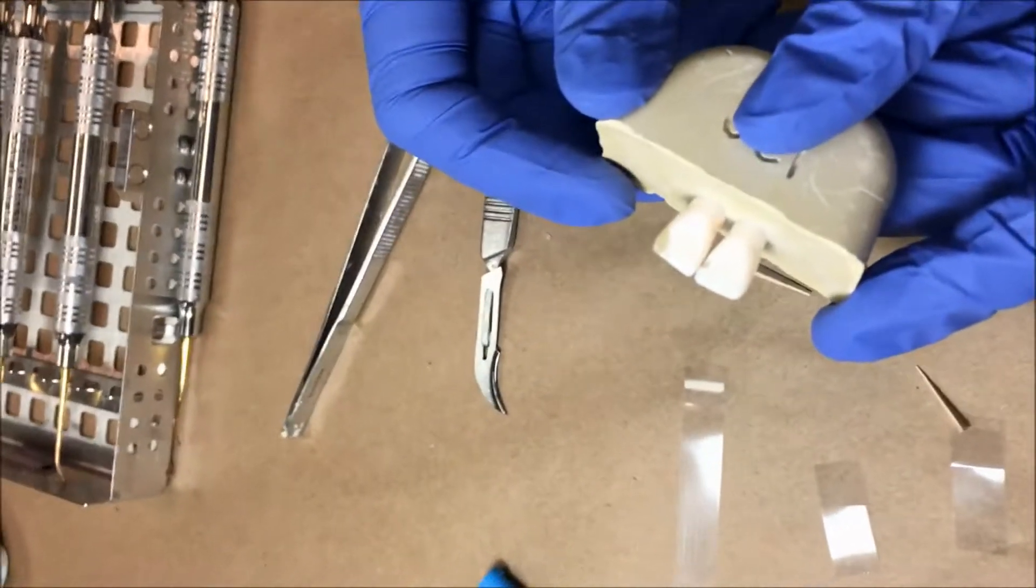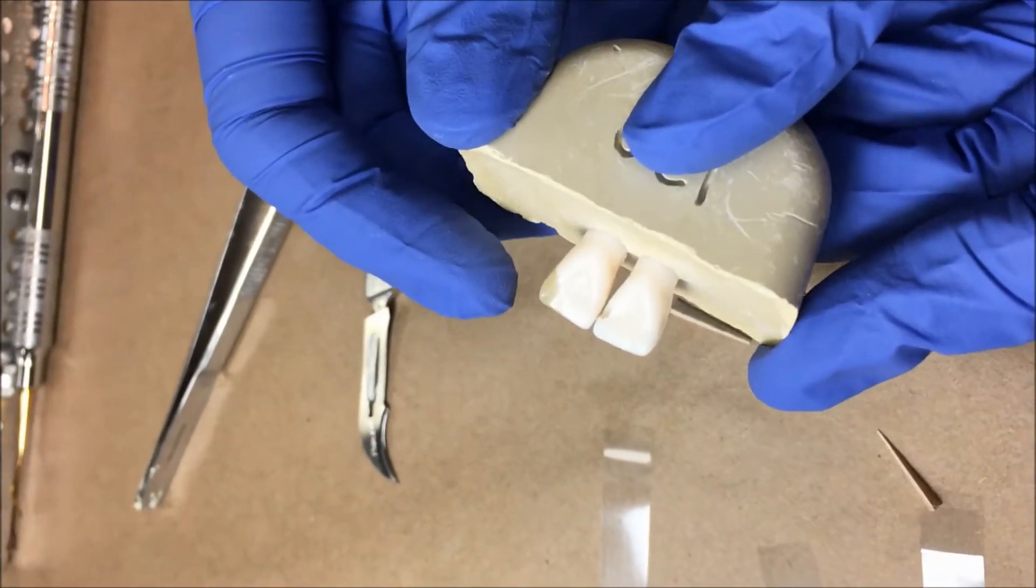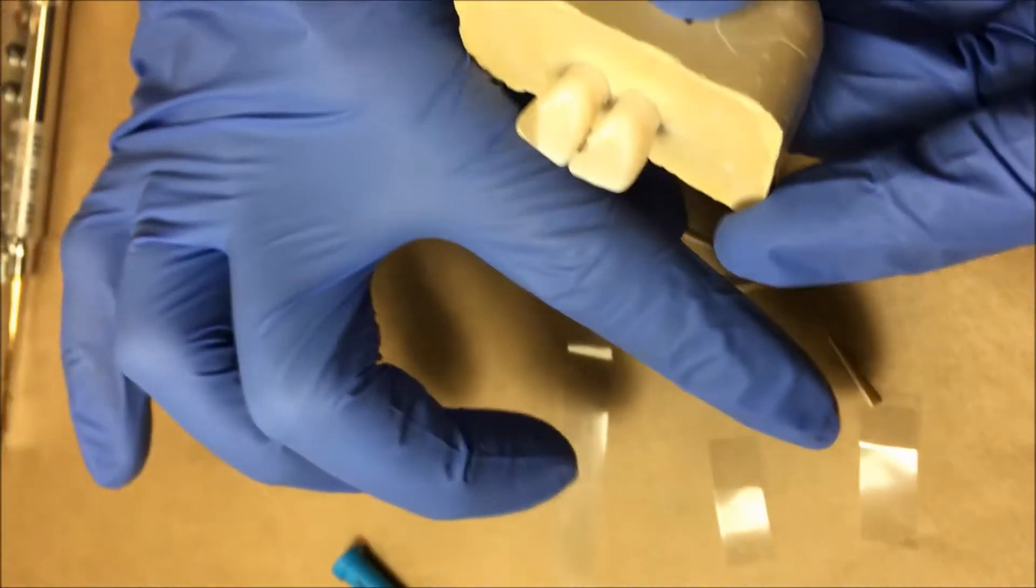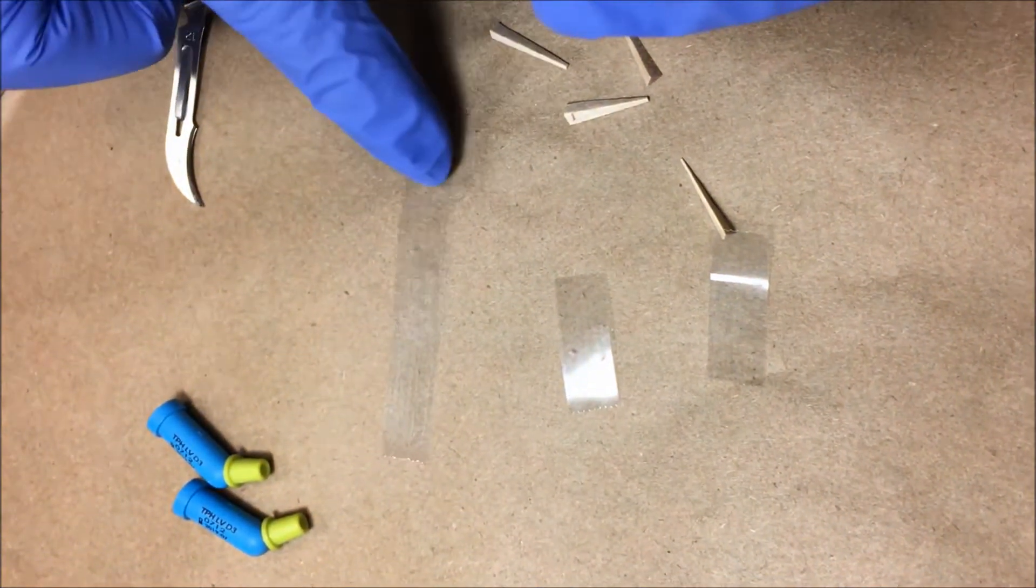Today we're going to show you how to place an appropriate matrix and how to hold the matrix when you're restoring the tooth. Note that I've got three different matrices here. This one's too long.